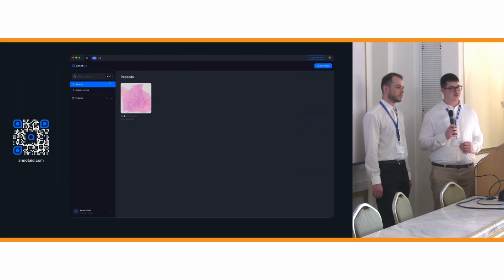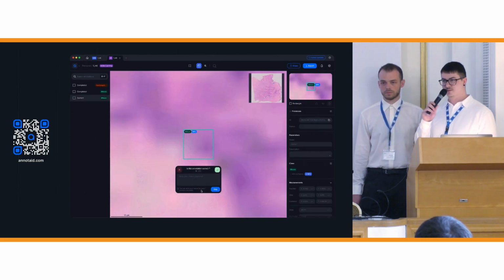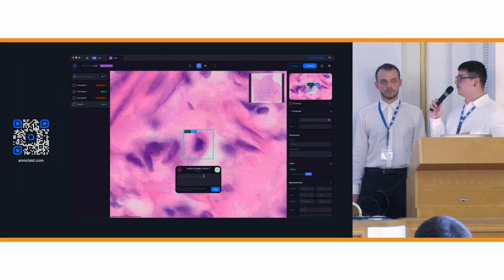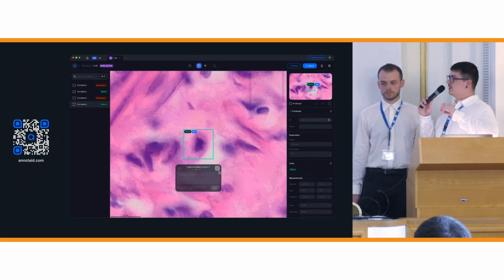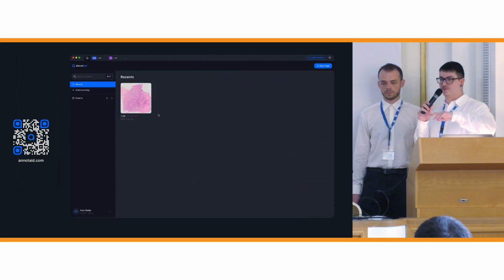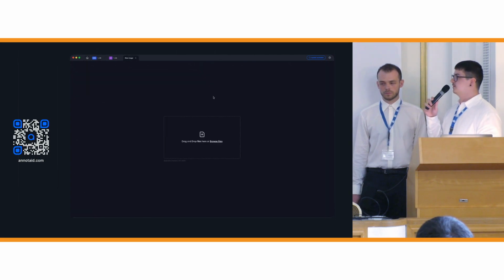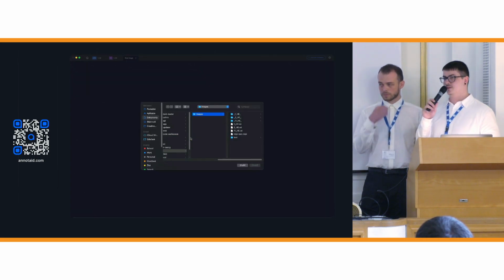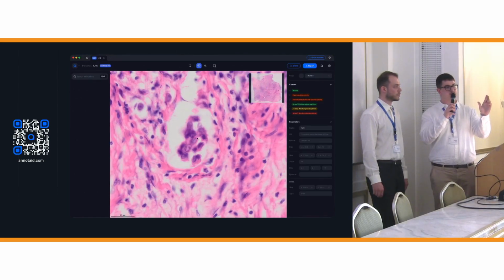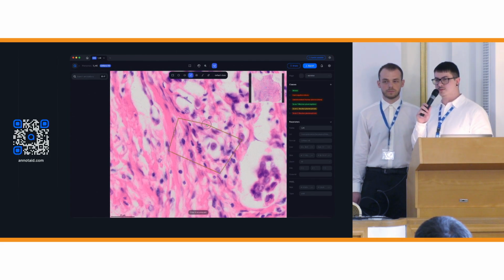We implemented the simplest version of this active learning because we only need this type of response from the user, whether it is correct or not. It will be our future work maybe to correct the annotations, bounding box or size, or to assign them a different class, for example.